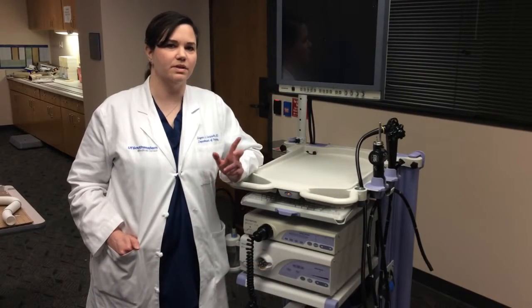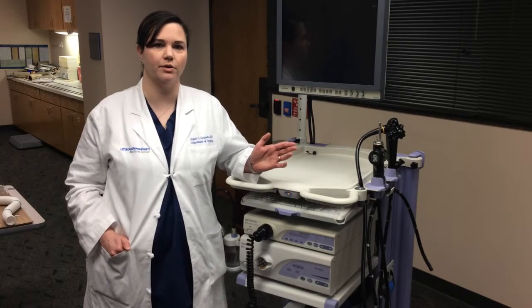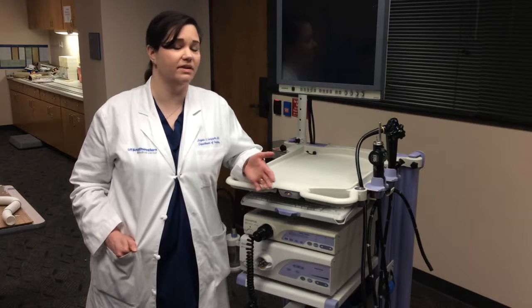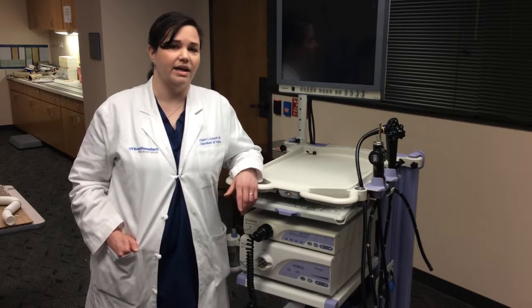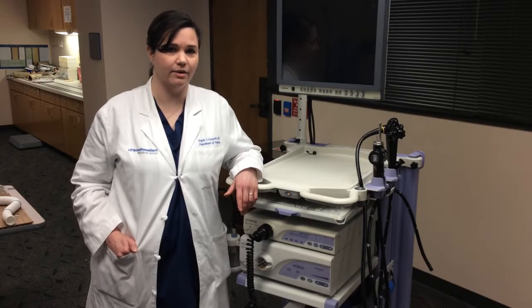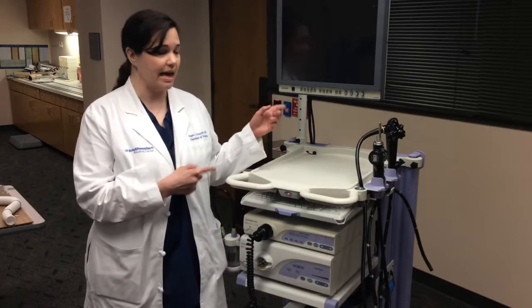Hey guys, so the first thing I want to do is show you how to set up the scope, partly because you're going to be doing it on your own when you're practicing, and partly because you may be at a place even less helpful than Parkland, and you're going to need to know how to set up your own scopes when the nurses have no idea how, and it's 3 o'clock in the morning and you got a patient bleeding. So this is our tower right here.